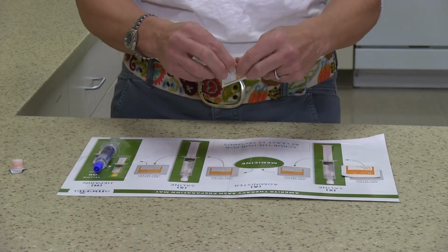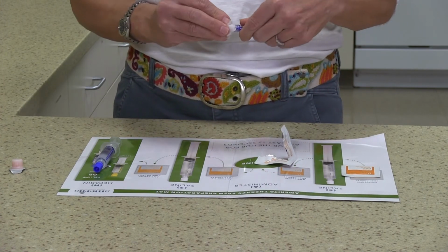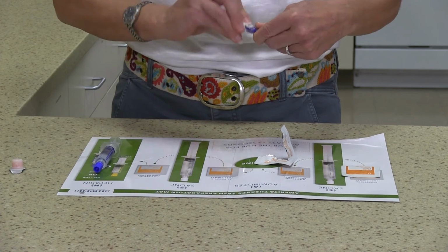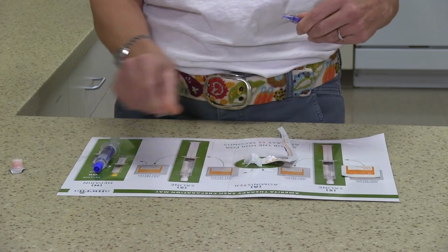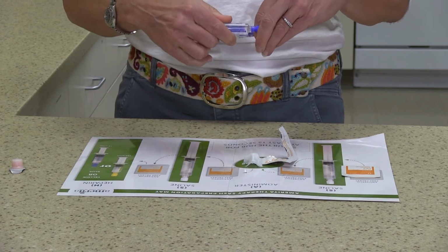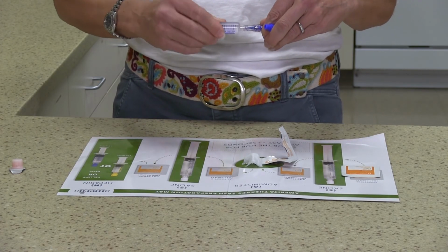If you have been instructed to do so, you will now repeat the flush with the heparin syringe. Again, cleaning the injection cap with an antiseptic wipe for 15 seconds. The heparin syringe has 5 cc's of solution. The label on this syringe will tell you how many cc's to flush.